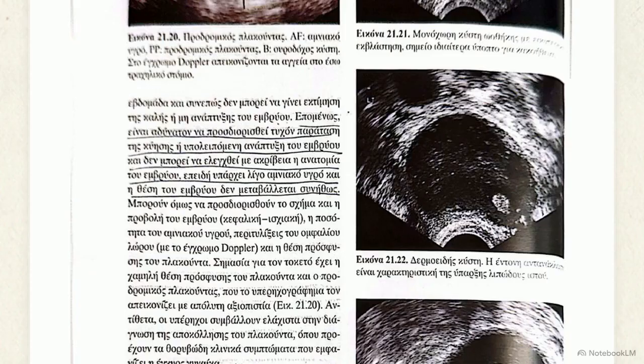This scan shows the clear signature of a dermoid cyst, or teratoma. Notice the intense, bright white echogenicity that casts a shadow downward. That brightness is caused by solid components like fat, cartilage, and hair trapped inside the cyst.